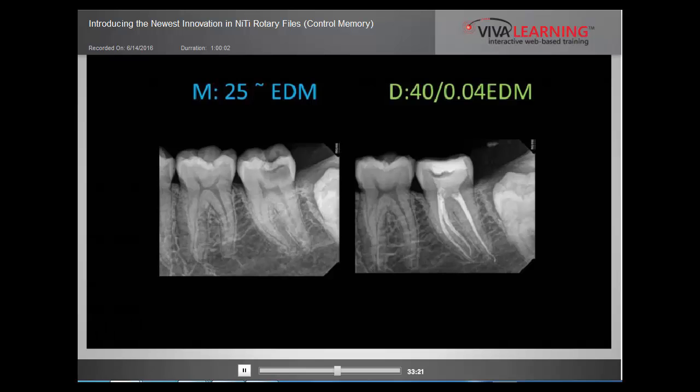Do this routinely in these shapes. So I'm an endodontist. Remember, I get very difficult cases in the United States. This is a football player. He plays college football here. Came to us, and he couldn't open much. He had a class 3 skeletal relationship. He had a second molar here with a deep carious lesion approaching the pulp, and obviously complex anatomy, as you can see preoperatively. Look at this first molar here. Thank goodness I didn't have to do root canal on that one.